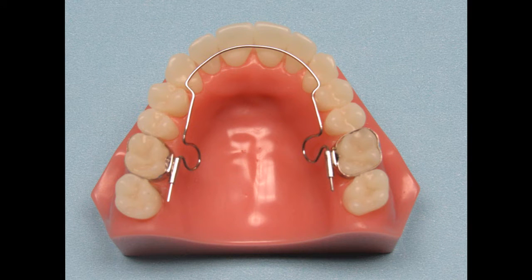This is the upper BWS appliance. As you can see, it is a light wire appliance that requires no patient compliance at all. There are no screws to turn or elastics to wear. All the patient has to do is show up every three to four weeks so you can activate it to get the desired movement.